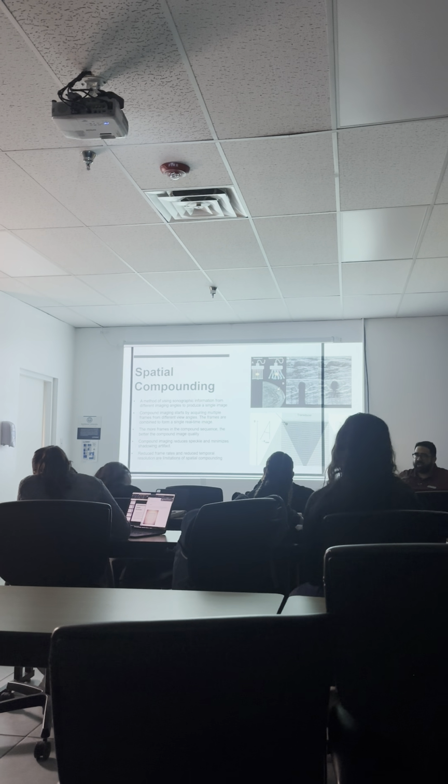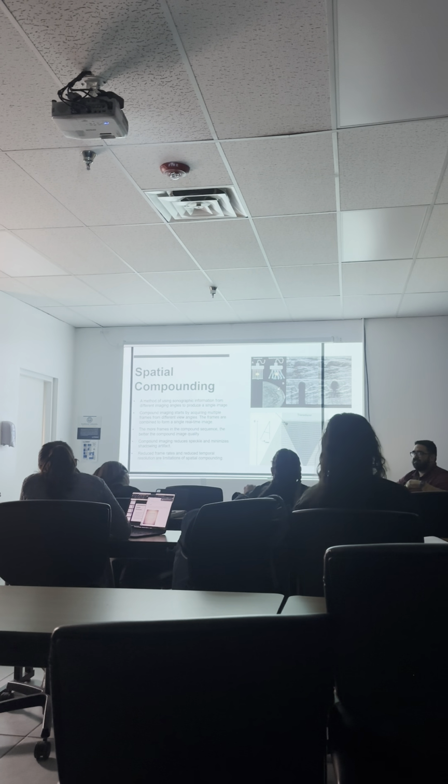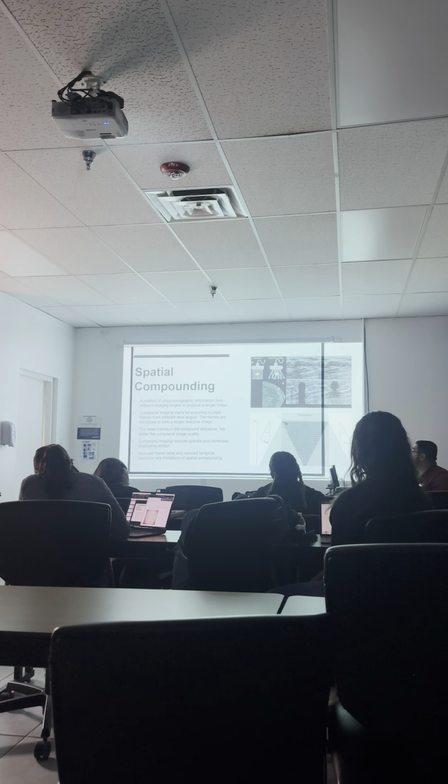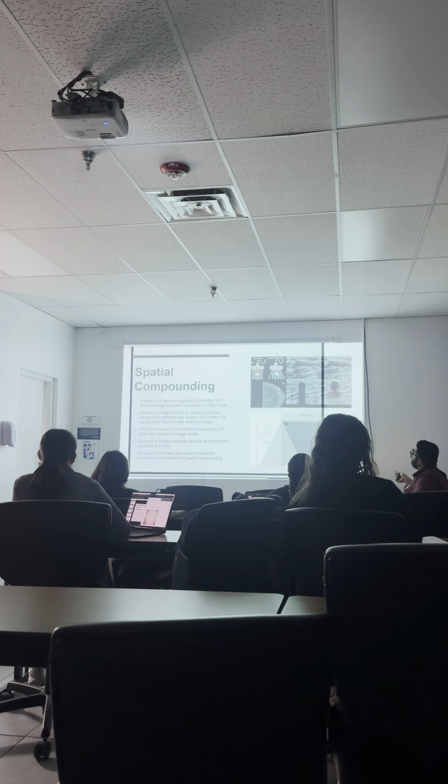Longer frame time, lower frame rate, lower temporal resolution. The spatial resolution will be improved, yes, as you can see by our images right here. Here we have the posterior shadowing artifact, and here, it fills it in, right?